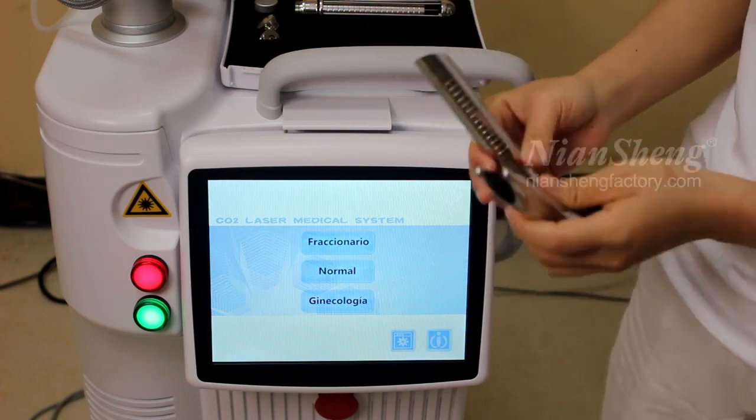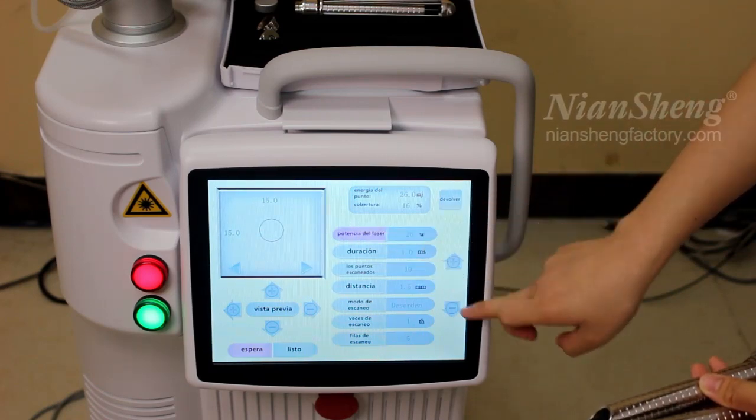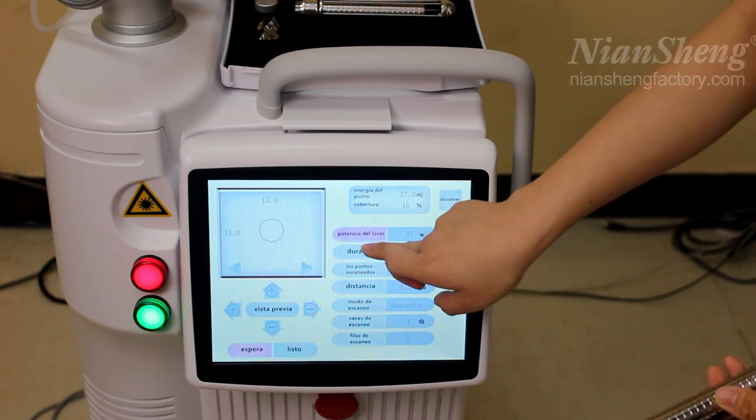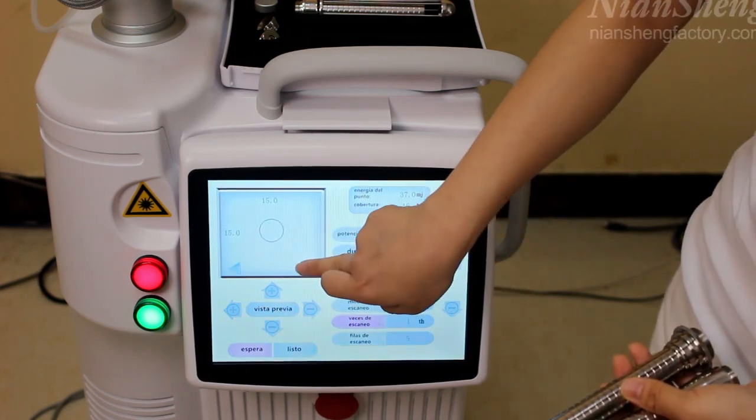So we go to the next part — this one is for the regular treatments. Adjust the power according to your client's needs. The maximum is 60 watts. And the duration and the treatment mode.